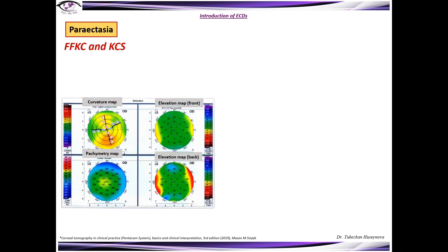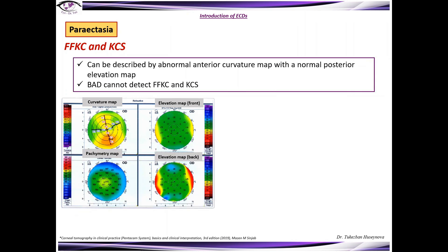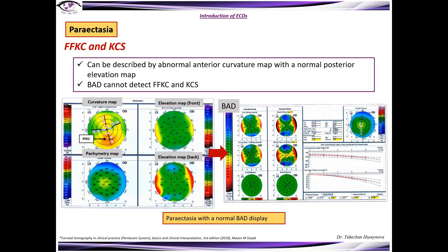Paraectasia includes form-fruste keratoconus and keratoconus suspect. These can be described by an abnormal anterior curvature map with a normal posterior elevation map. The Belin-Ambrósio display cannot detect form-fruste keratoconus and keratoconus suspect — as you can see, the display looks absolutely normal. However, the D-value is 1.96, colored yellow, whereas the D-value normally should be less than 1.45.